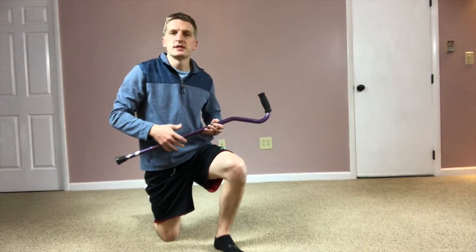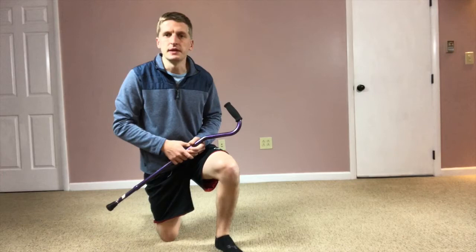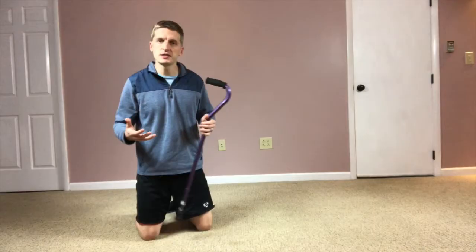Hi everyone, so today we're talking about how to use a cane after knee replacement surgery. This may apply to a lot of you. Not necessarily everyone is going to use a cane after surgery. A lot of times, you'll start out with using a walker, or maybe crutches, if you have a lot of pain and weakness and difficulty getting around. Or if you're getting around fairly okay, you might start out with a cane.